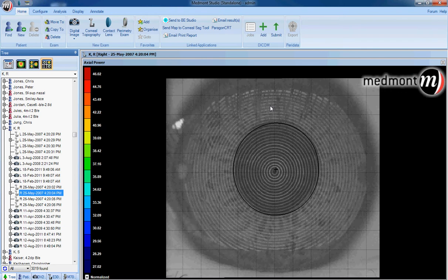This video describes the fitting of the ICD 16.5 millimeter scleral lens from your Medmont E300 corneal topography fitting software. Start with a placido reflection well centered to the geometric axis rather than the visual axis.